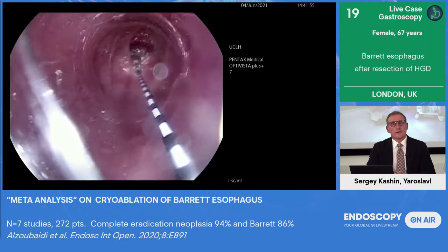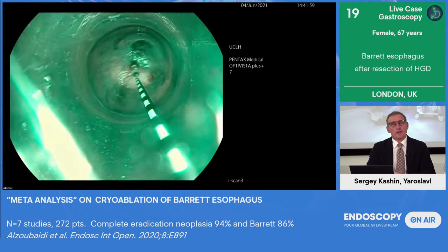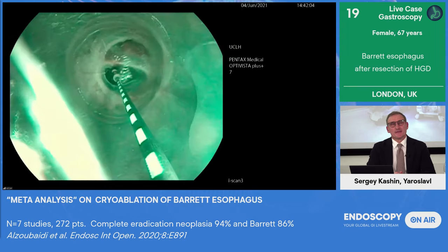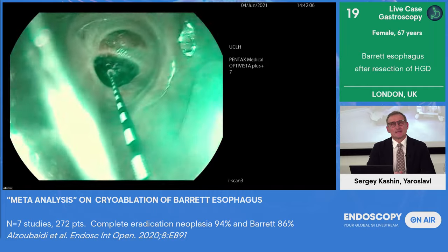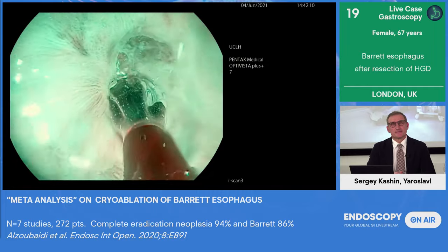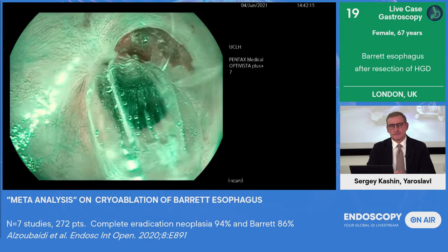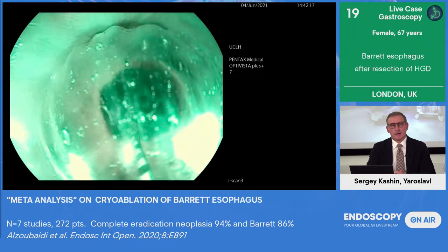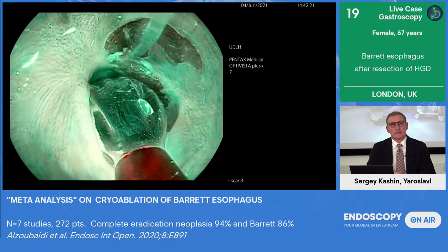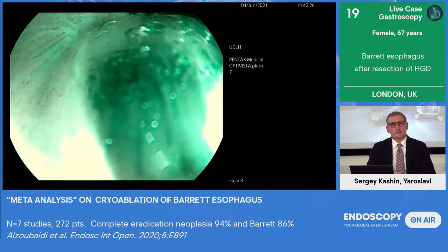Hi, Rehan, sorry. Is it possible to perform balloon dilation with the cryo balloon? Yeah, that's an interesting question. No, because the radial force that is generated from expanding this balloon is not high enough. It's the PSI, I think it's about 4.5. It's not enough, as you can see here, to cause any sort of mucosal irritation.